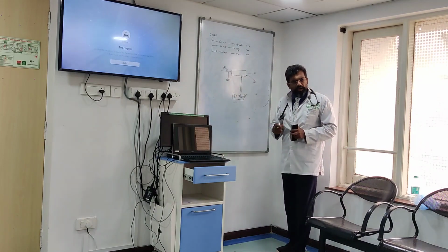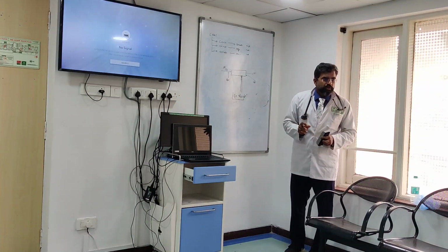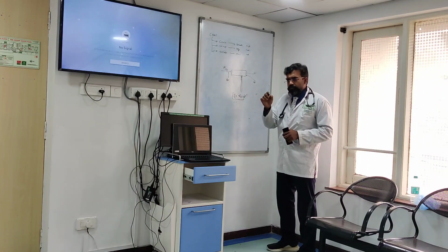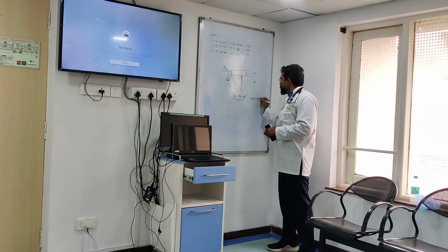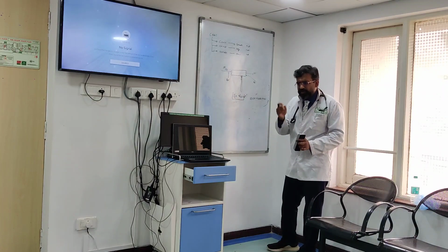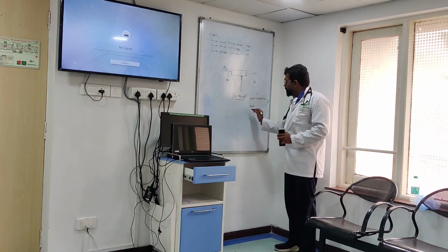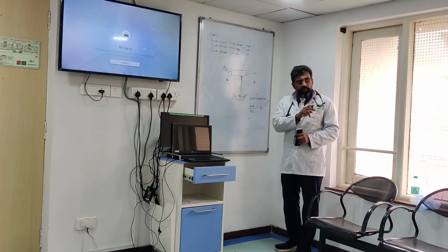This is my dose. Now let us take our patients that we have. I am giving a regular dose. What is the regular dose that I am putting in on the machine? Kanchan? 1000 ml dialysate, 1000 ml replacement. Okay. So 1000 ml dialysate plus 1000 ml replacement plus 100 ml UF. This is what I normally put to start with. It will become 2100, divided by 70. How much is it? 30. What is the dose we require?